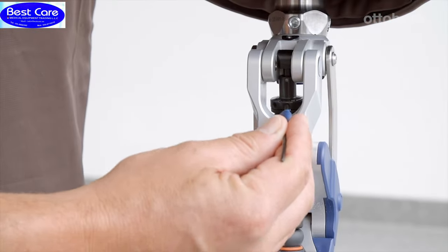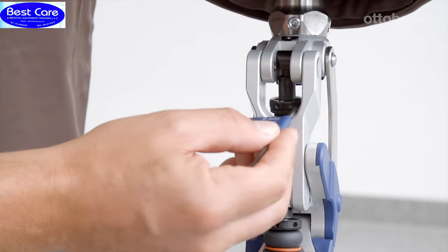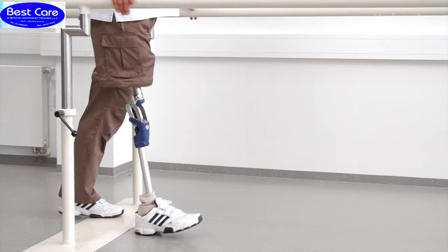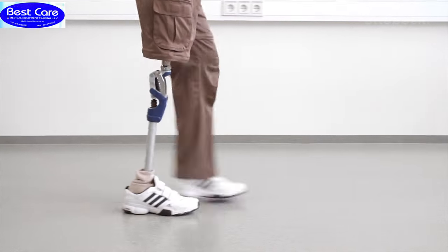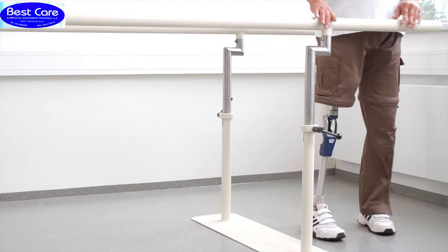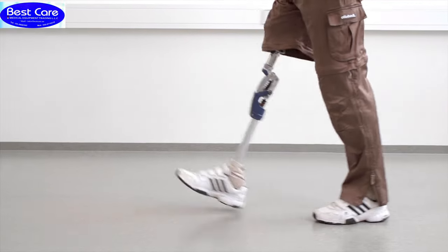During swing phase, the spring effect of the extension assist prevents the knee from flexing too much. The extension assist is adjusted by turning the upper adjustment ring. As shown in the video, a spring tension that is too tight will cause the knee to flex too little, and also the shank will swing forward too quickly. This results in a hard extension stop.